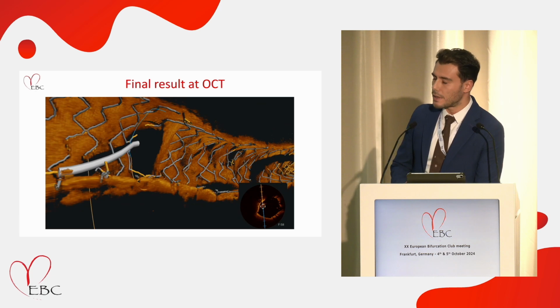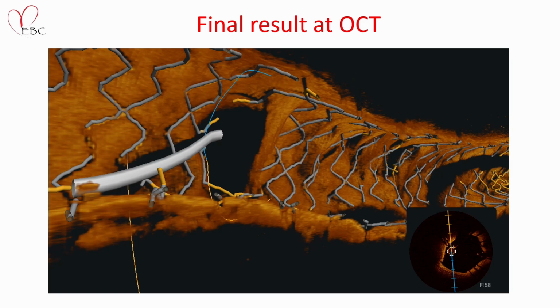So this is a very nice image that I would like to show you, because the 3D reconstruction, the fly-through mode of the OCT, allows you to appreciate a lot the effort that you put into performing a good distal rewiring. This is very important to avoid any metallic carina and, in case of a pot-side-pot technique, the shift of the metallic carina towards the lumen of the main vessel. So this is very important.